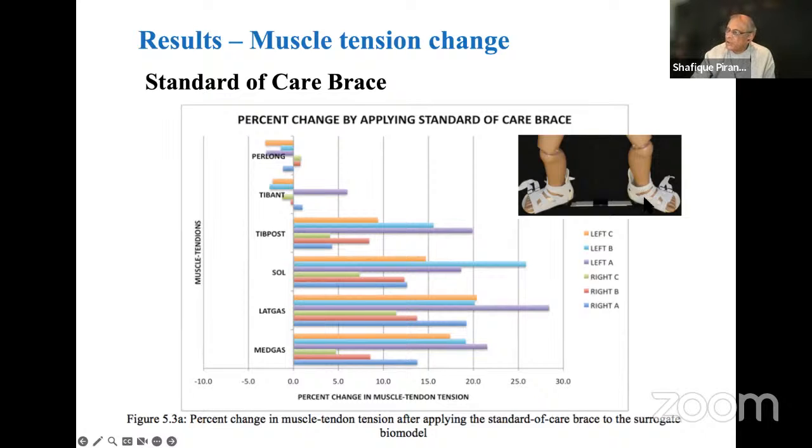So, in the unilateral case, let me rephrase. In this brace, the normal foot needs to go in at 30 degrees. Only the club foot needs to go in at 70 degrees. So if you're asking me about the braces you have available, which I think may be 70 degrees on both sides, that is maybe a bit extreme for a normal foot.